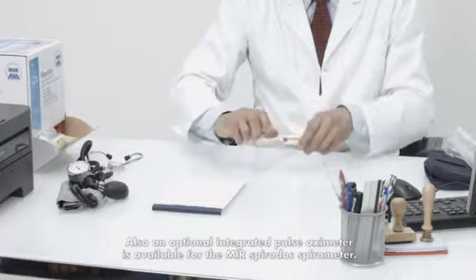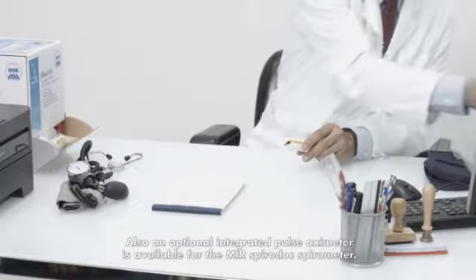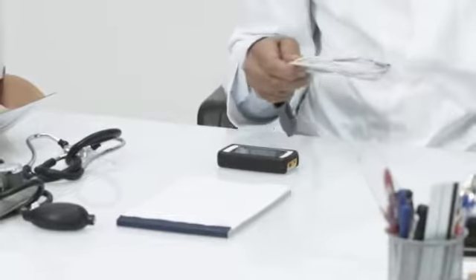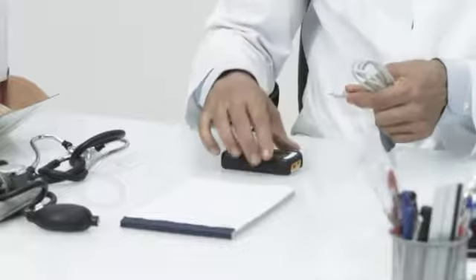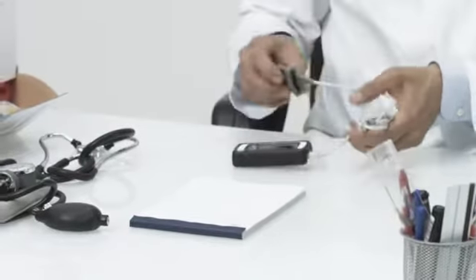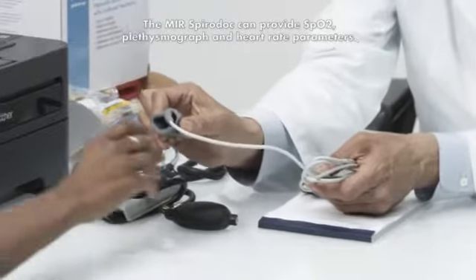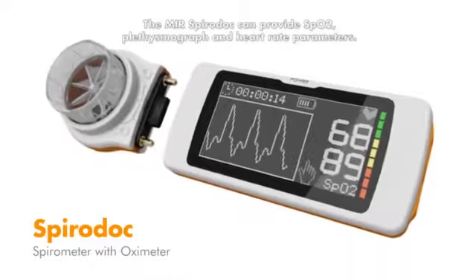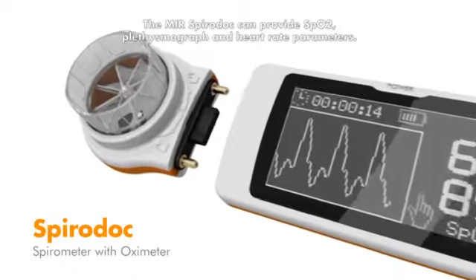Also, an optional integrated pulse oximeter is available for the MIR SpiroDoc spirometer. It can provide SpO2, plethysmograph, and heart rate parameters.